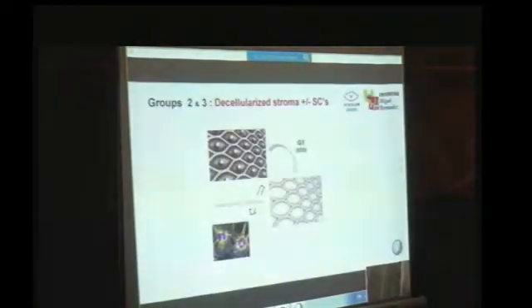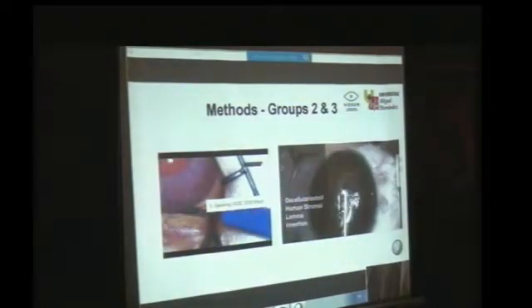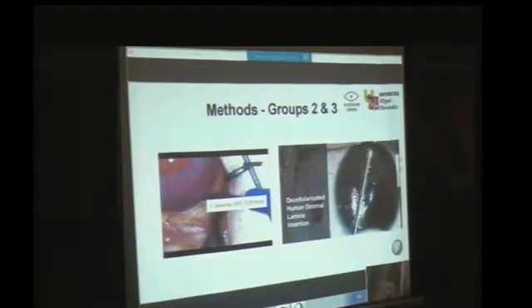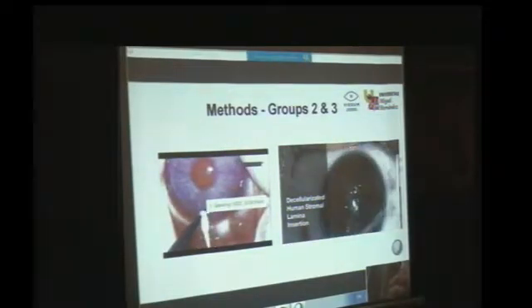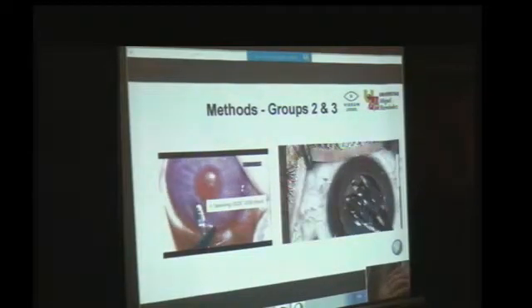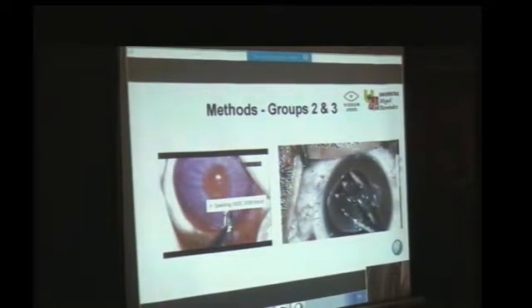So we use, in this case, laminas with no cells implanted in the human cornea. Look here how we are dissecting the pocket, and we are using a lamina with no cells. On the left you have the experimental model. This is a rabbit eye, albino rabbit. While on the right you have the first implantation in one of our patients. It was the first human implantation.